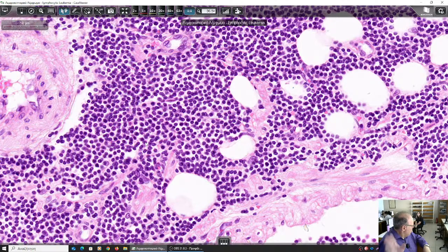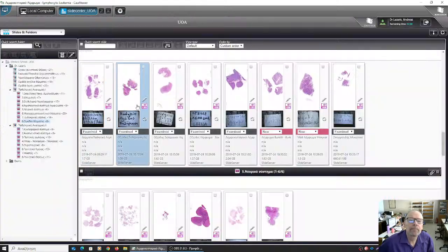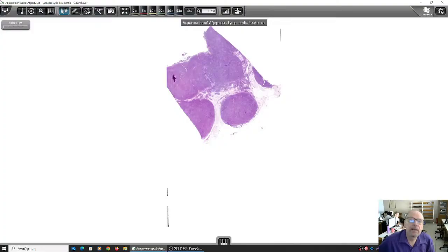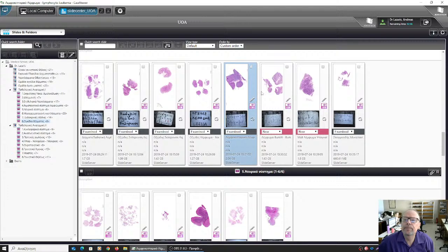So what does this lymphocytic non-Hodgkin lymphoma express? It expresses B-cell markers, restriction of light chains, and CD5, CD23. Okay? Deceptively benign, but of clonal nature. Lymphocytic lymphoma, and leukemia if these cells circulate in the blood.